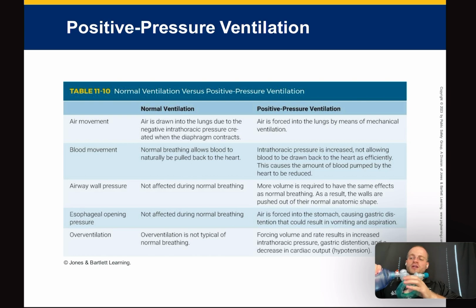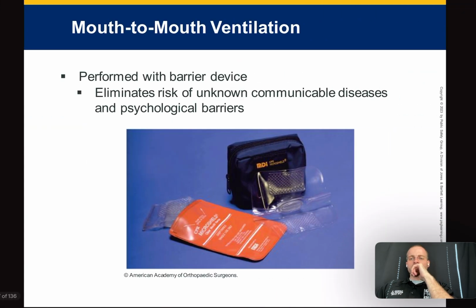If you overventilate a patient with a bag valve mask, they will vomit, even if they're dead. Okay? It's called passive regurgitation. So just be aware that there is a consequence of overventilating. I know sometimes we think, I'm an EMT, I fix things, right? And so we just start ventilating them, thinking some is good, more is better, and it's not the case. So don't overventilate patients. That's enough of that.